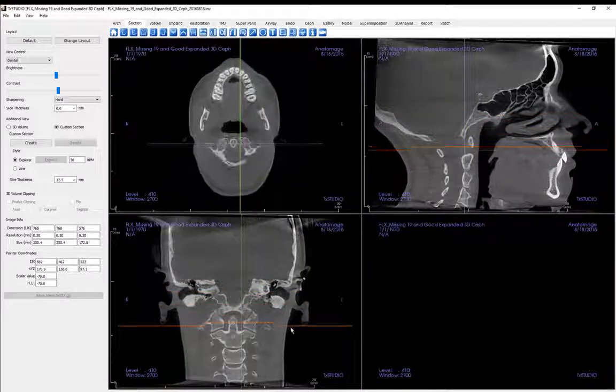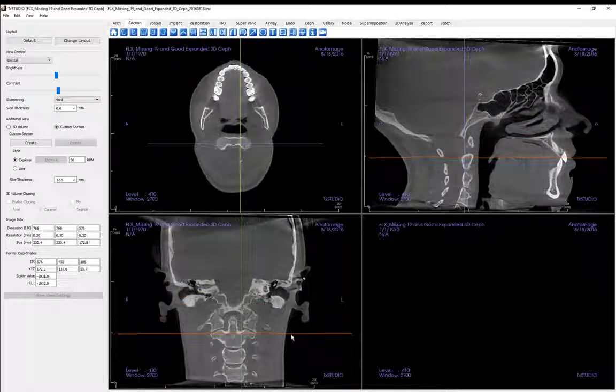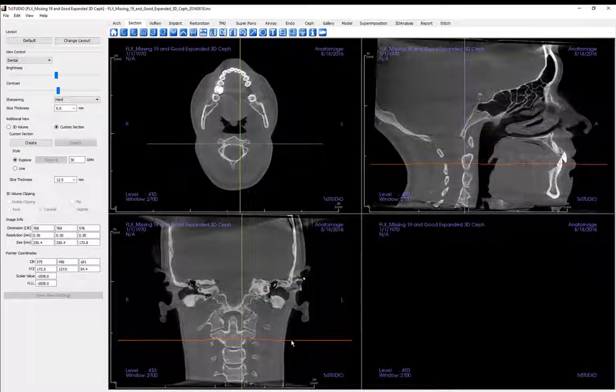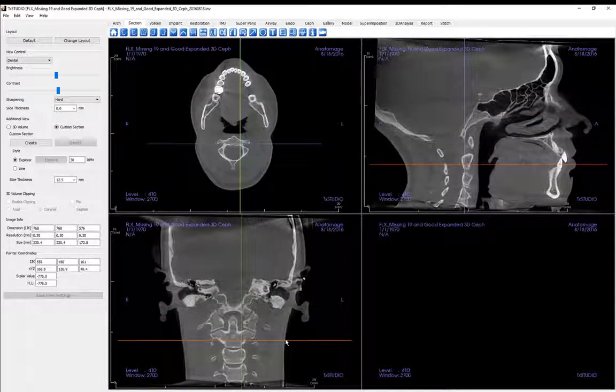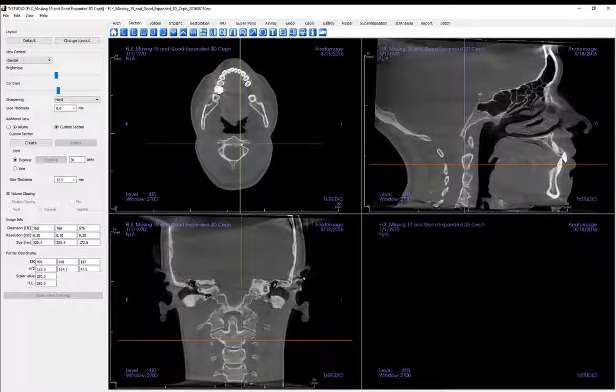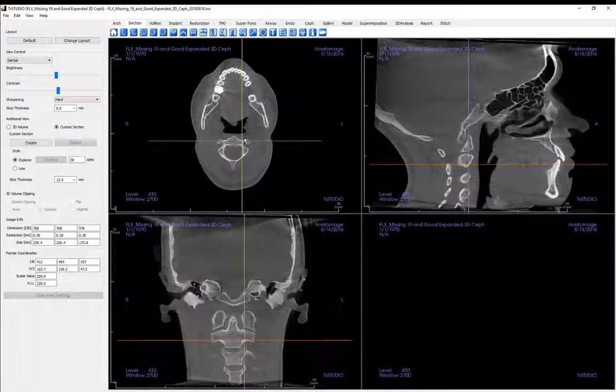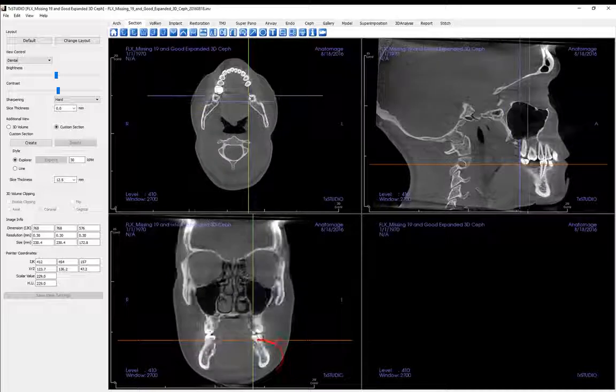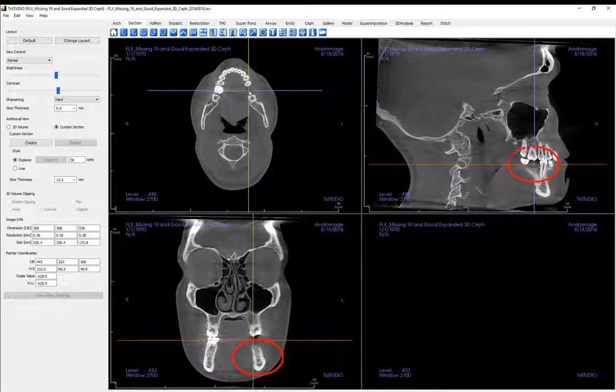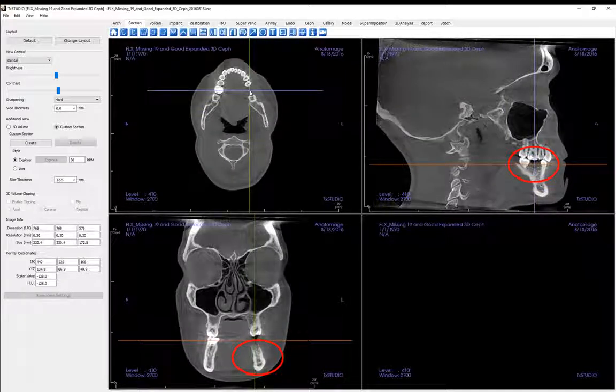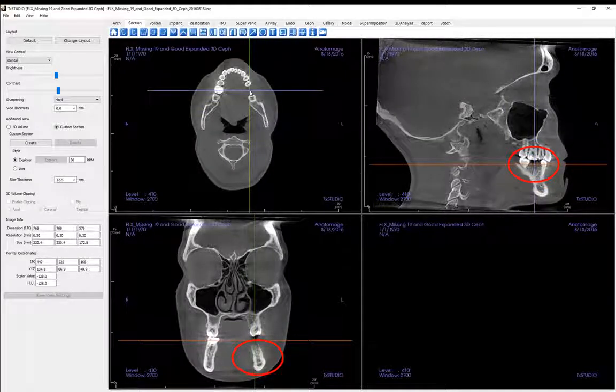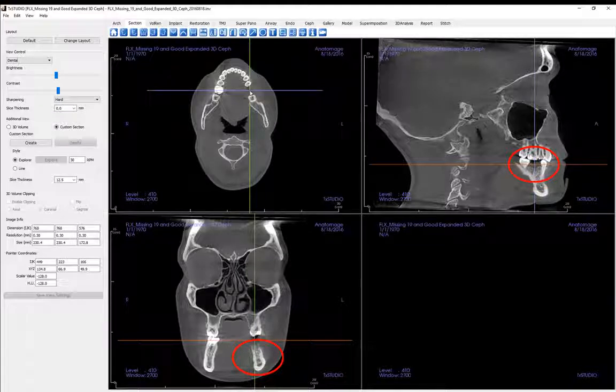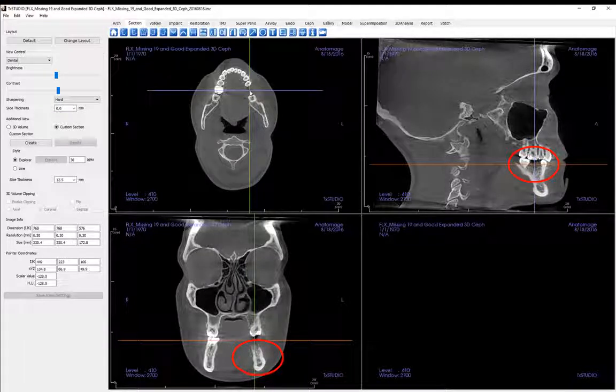Lastly, you may place the mouse pointer at the intersection of the cursor lines and, while depressing the left mouse button and holding it down, move your mouse to an anatomical location of interest. Two corresponding orthogonal views of the selected region will automatically appear in the associated view windows.